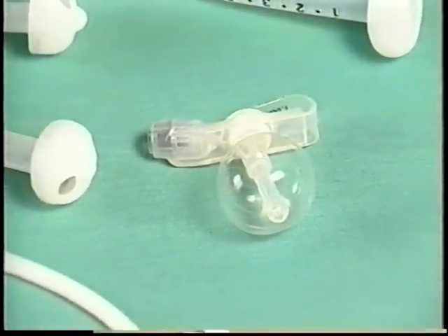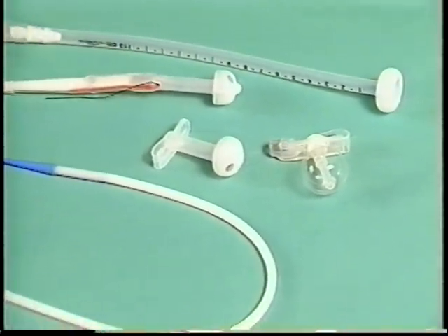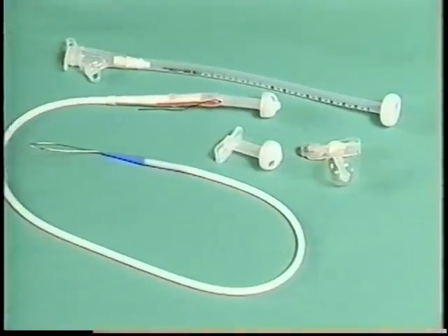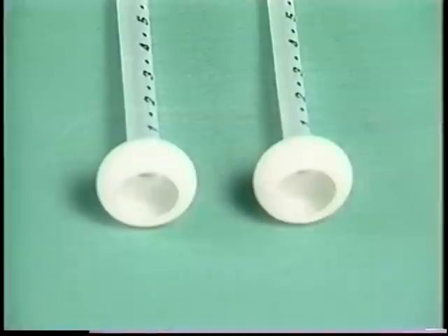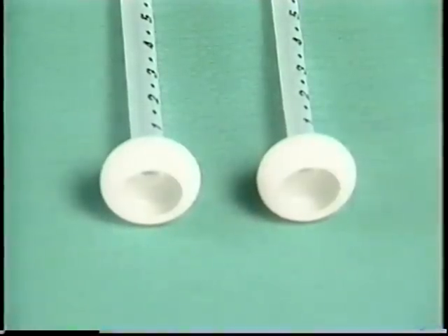PEG tubes are available in a variety of designs. Some are used to establish the initial access for feeding. Others are designed to replace that initial tube. PEG tubes also come in a range of French sizes. If I'm trying to pick a device, frequently if I have someone who needs a PEG tube placement where I feel they aren't going to require a J tube anytime in the future, I use a 20 French tube. And if I have somebody who I feel is going to require some jejunal feeding or a PEGJ, I'll jump to a 24 French tube.